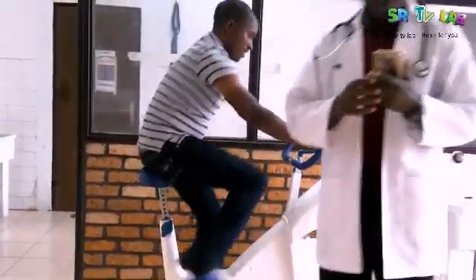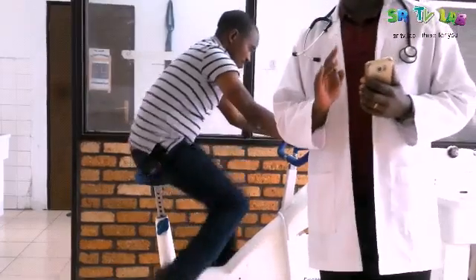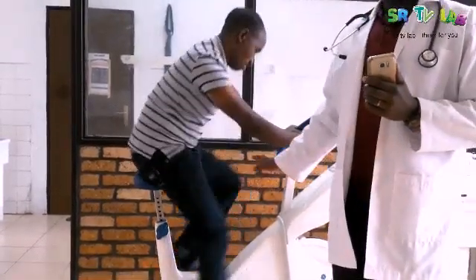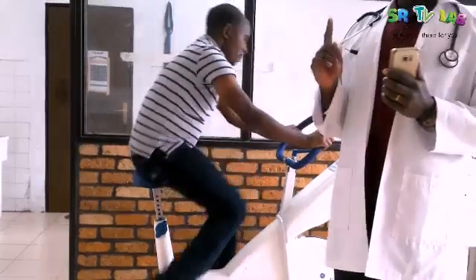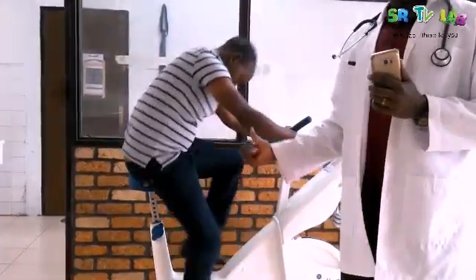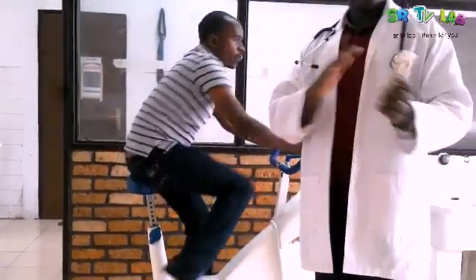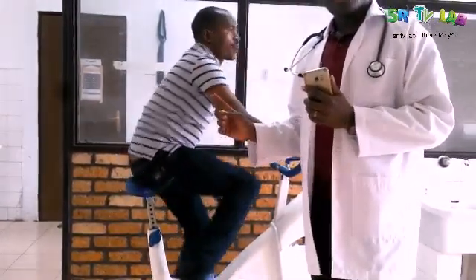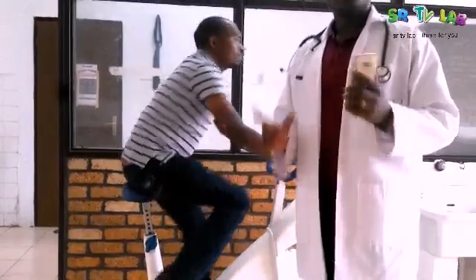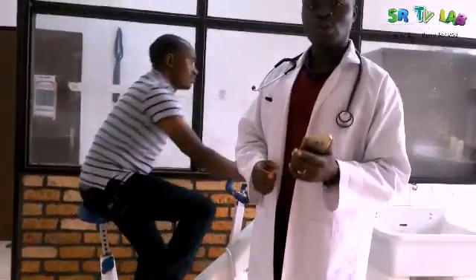Our patient is doing good. Remember, we add weight after every 2 minutes. We have added 3 weights so far. After 2 more minutes we add one more weight, and then we check the blood pressure to compare blood pressure before the exercise and blood pressure right after exercise, to see if there is any difference.